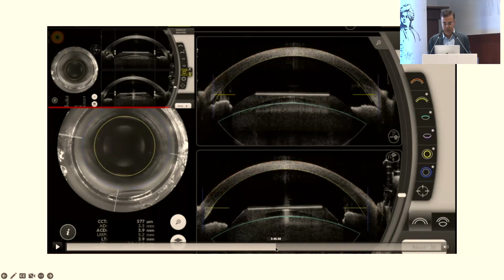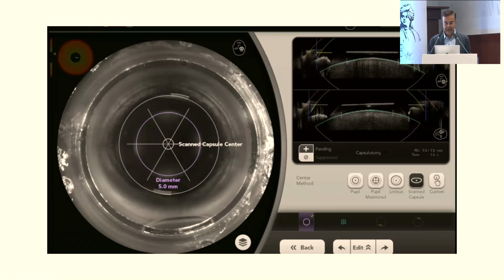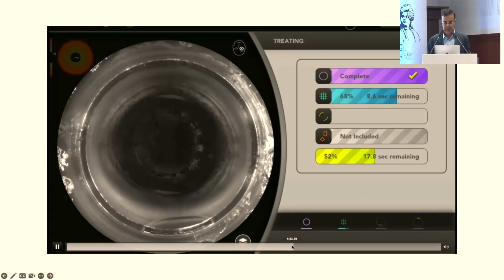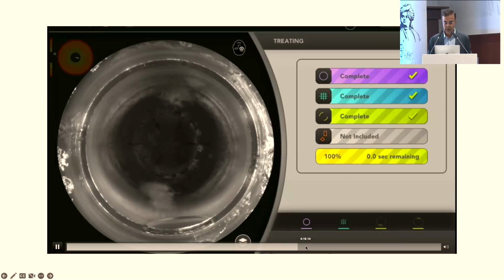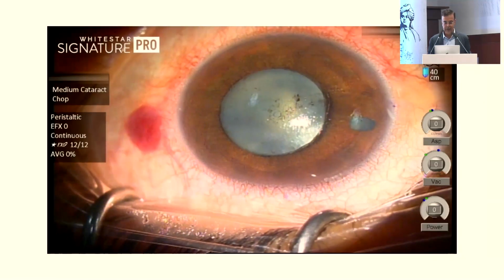So not important messaging here regarding that, but frankly, you can then do a very good rhexis under the ICL, and that will ensure that you still get a good rhexis. And so anyway, we've managed to do this, and let's not waste time on this, but that's just one way.